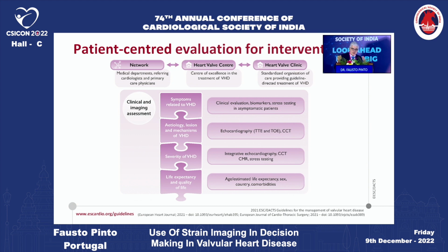And those are all the questions and interrogations that we have when we look at the individual patient, trying to define the right timing, not too late, not too early, to identify the right timing for intervention. And here is where the use of imaging can really be very useful. You heard already a lot about the use of echocardiography. Other imaging modalities are becoming more and more relevant in improving the assessment of the individual patient.